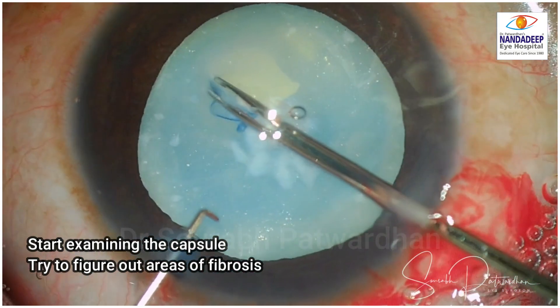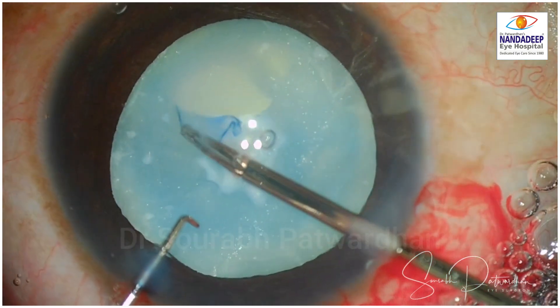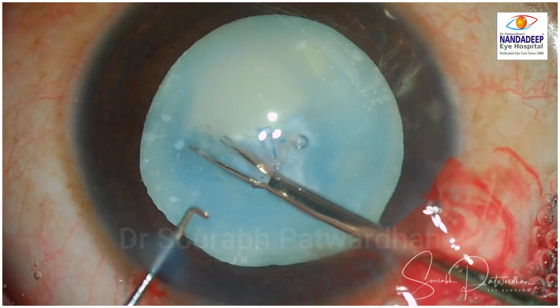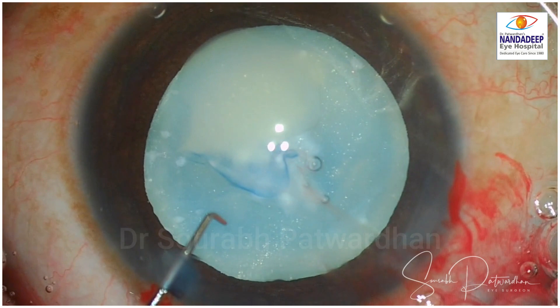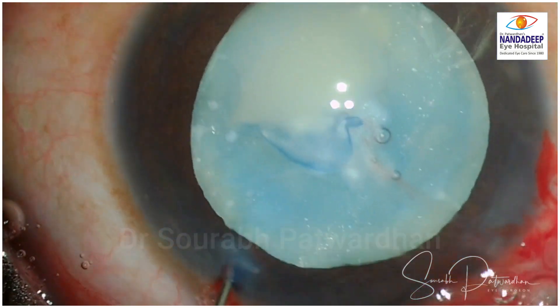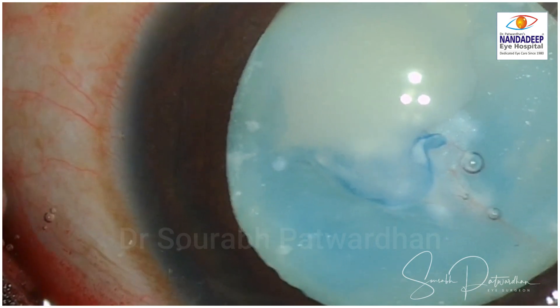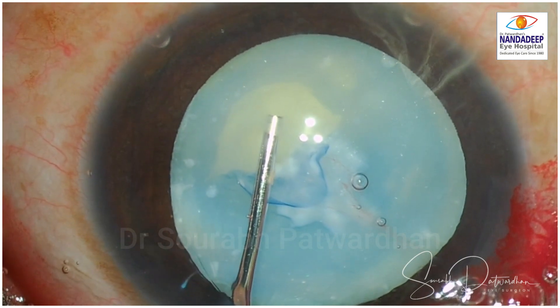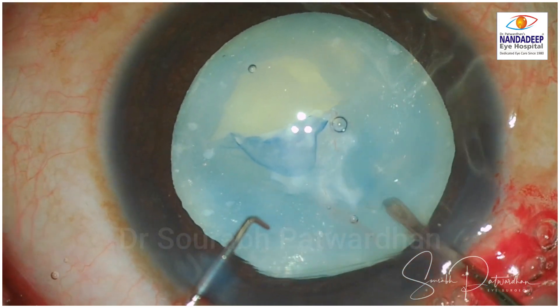Once I made a nick in the capsule, I started doing capsulorhexis using the forceps. Remember, always pull this flap tangentially and never radially, as zonules may give away if you pull centripetally with force. Here I stopped because you can see the tear is trying to go radially out — that is a red flag sign. I had to stop and aspirated the liquefied cortex to get a clearer view.